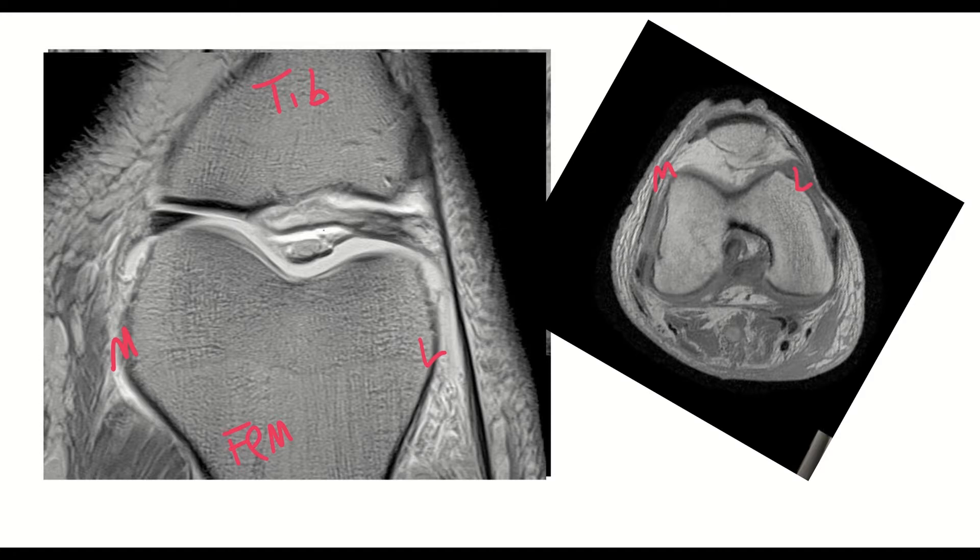Here is the medial femoral condyle and lateral femoral condyle. If we flex this out of the way, our needle comes in from medial to lateral like this, and the visco supplement from the last video rested right here. On the picture on the right, the needle path would be through the skin, through the fat, and then down onto the down-sloping margin of the lateral femoral condyle, and the visco supplement would fill up the notch.